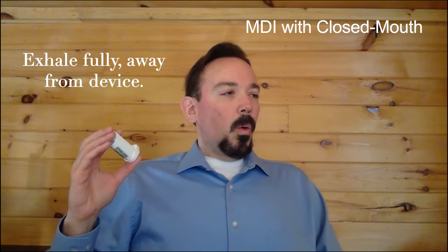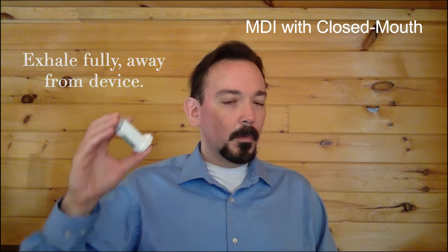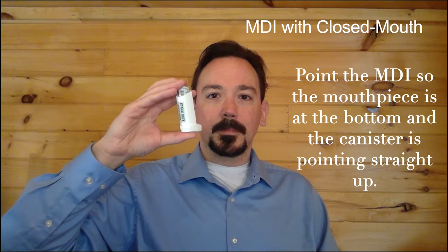Exhale fully away from the device. Hold the MDI so that the mouthpiece is at the bottom and the canister is pointing straight up.